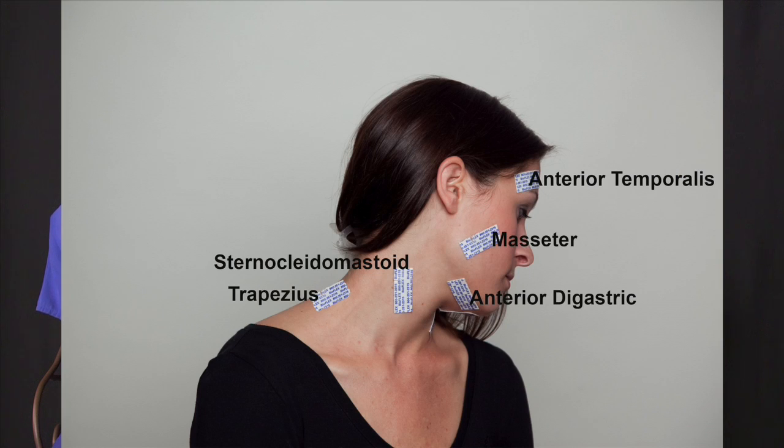So basically the electrode leads that they see in the videos or in photographs don't impart any kind of electrical signal into the body. They only sense electrical activity from the muscle. Correct. They're not imparting any current into the muscle. They're listening.